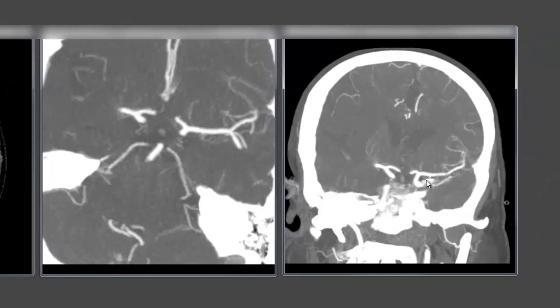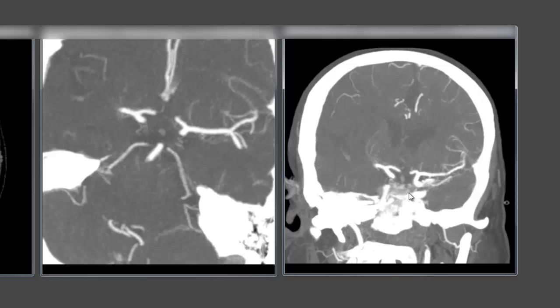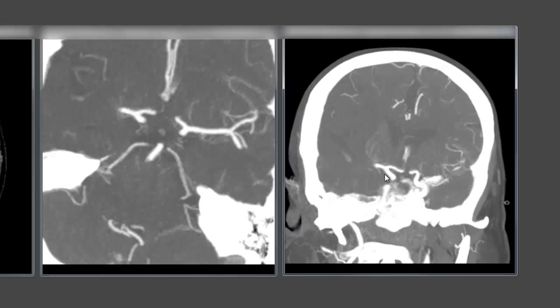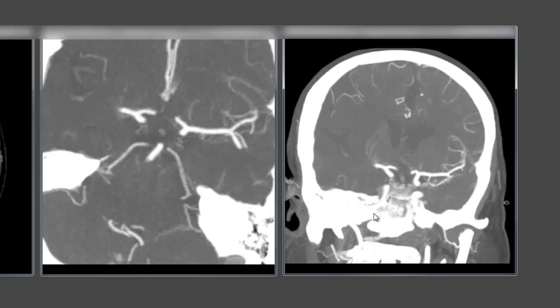That's just as well, if not better, seen on the coronal thick MIPs reconstructions. We can identify the top of the carotid with the normal left MCA, the top of the carotid on the right side, and the hard cutoff.